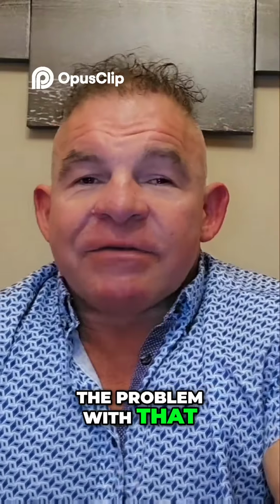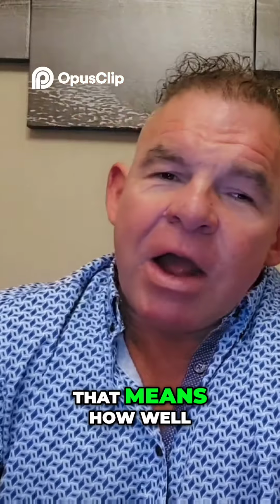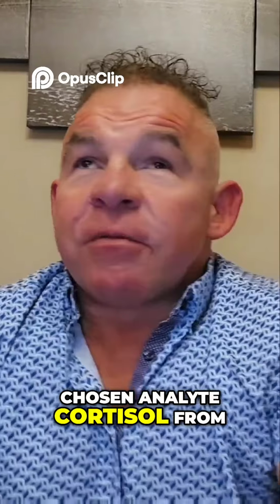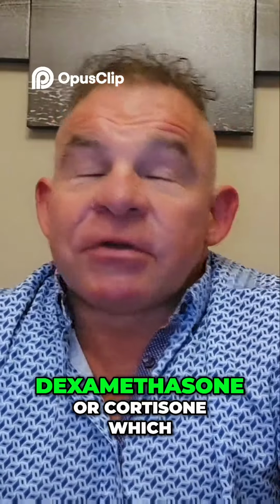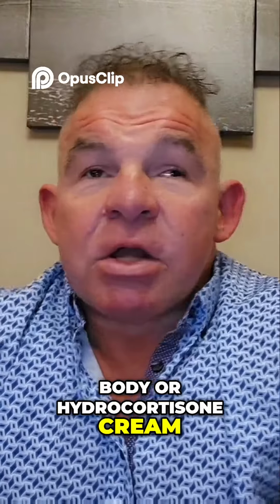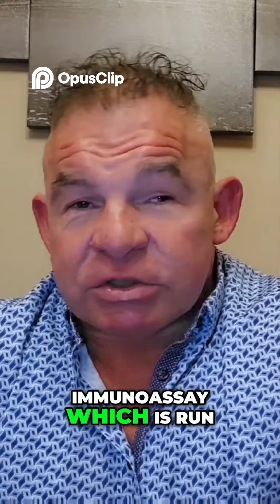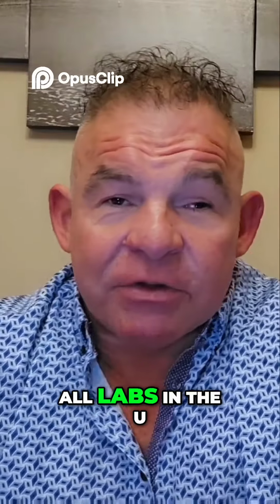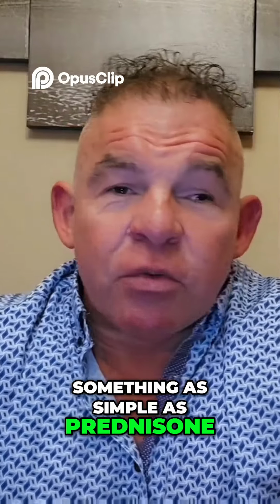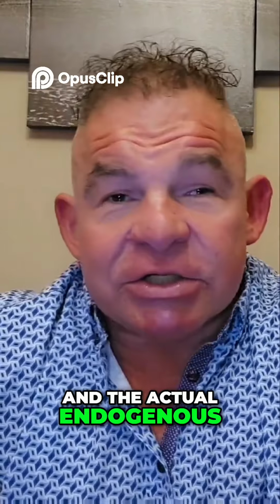Now, the problem with that is that when you indirectly measure something, you begin to lose specificity. That means how well you can distinguish the chosen analyte, cortisol, from, let's say, prednisone or dexamethasone or cortisone, which is also in the body, or hydrocortisone cream. The reality is that due to the lack of specificity, the traditional immunoassay, which is run by 90% of all labs in the US, cannot distinguish between something as simple as prednisone, which you might be taking if you had an infection or you needed a corticosteroid, and the actual endogenous marker cortisol.